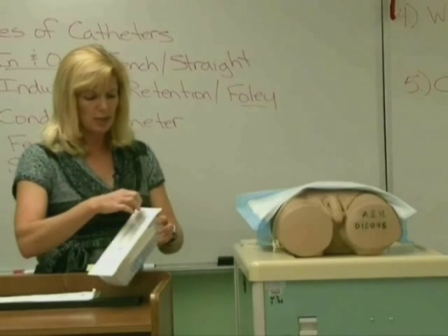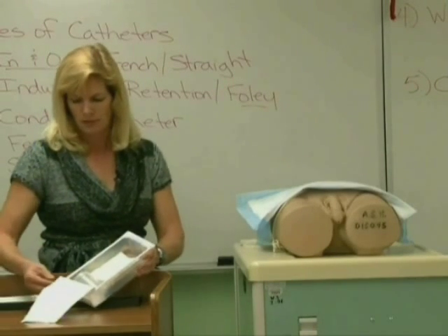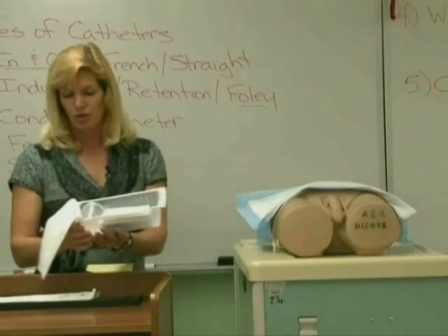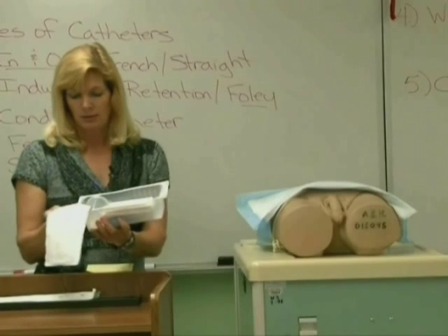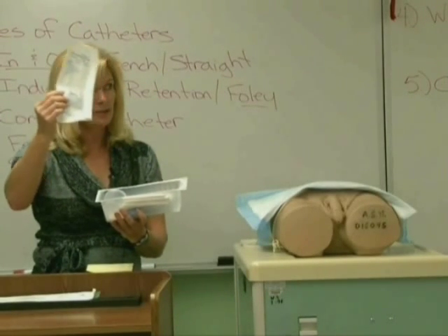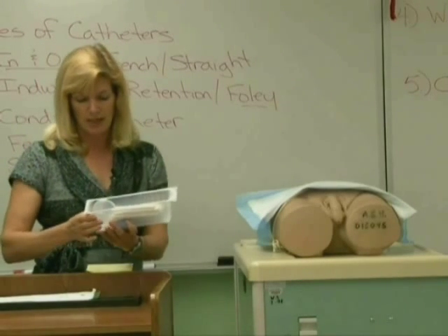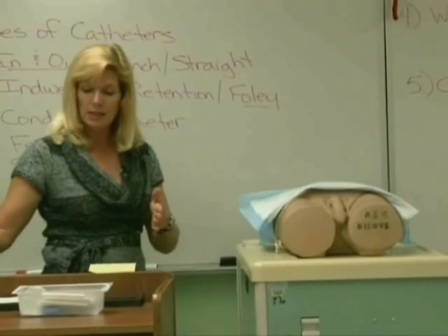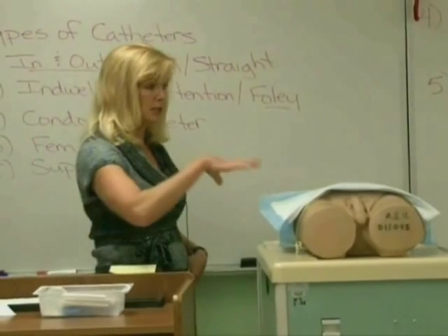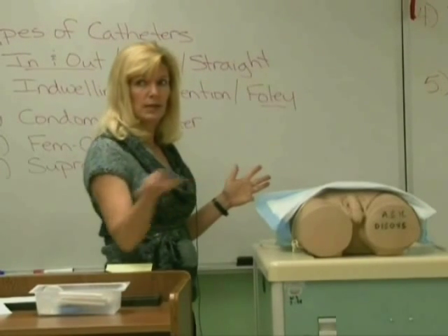Go ahead and open up your sterile equipment. Do not touch anywhere inside the sterile tray. Save the information sheet that has your information on it for documenting — put that to the side. If you're right-handed, you need to have your bedside table on your right-hand side and stand on that side of the patient so you can work with your right hand. If you're left-handed, you need to be on the other side.